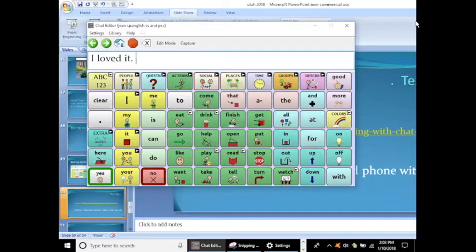That's neat. So it works really good. You just do have to have a Samsung phone. They don't have an app for the iPhone. And actually, you can do something with the iPhones, but you have to do iMessage, that's what you can do. With locked devices, you can't do it, locked iPads, but you wouldn't have a locked iPad. That's a useless device. Don't do it.